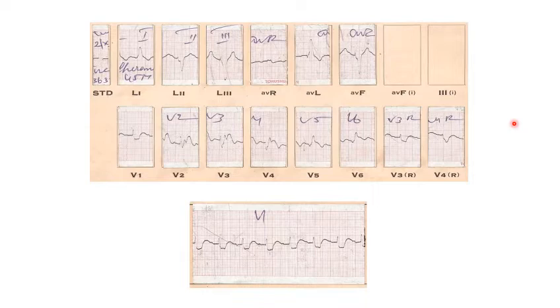Where is the notching? In the V1 rhythm strip, terminal part of the QRS. Sir, in all the complexes, we can see the slurred S wave, some notching. Okay, what is it due to? Sir, that may be due to fragmentation, sir. More likely than fragmentation. Some P waves may be buried, sir.